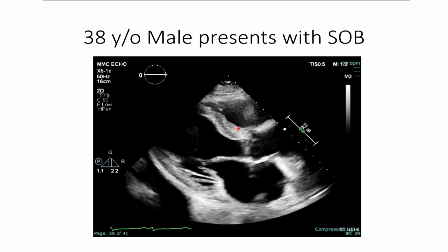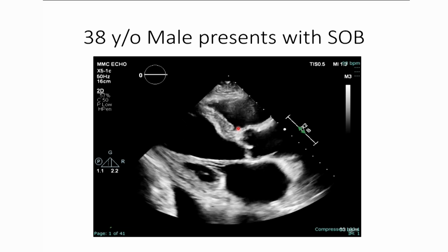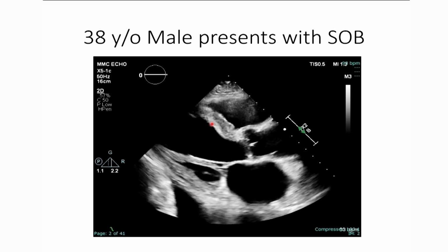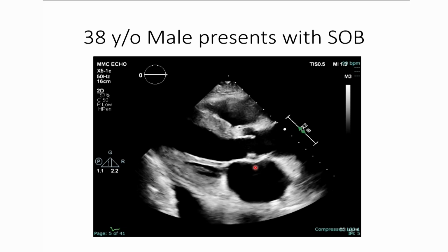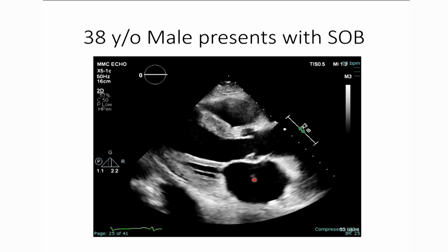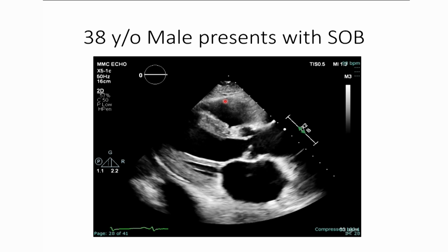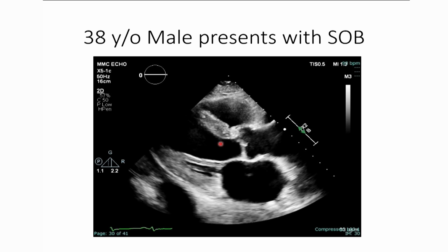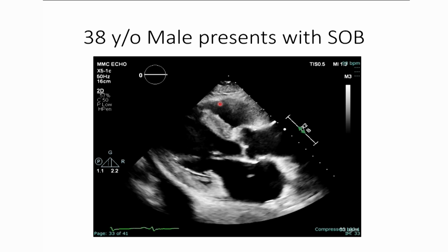Keep going. So here's a 38-year-old male who comes in with shortness of breath. Maybe the LV doesn't look so bad, a little thick. The left atrium, maybe a little dilated. We have a nice little reverberation artifact here. RV looks okay. Maybe the LV's dilated. Let's see, this is a centimeter, so we're close to 5 centimeters or so.